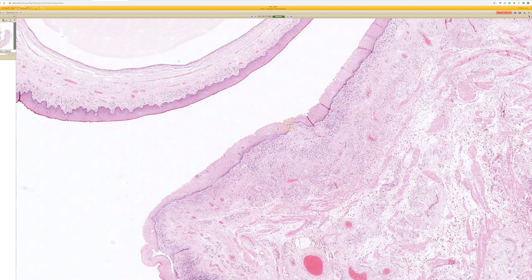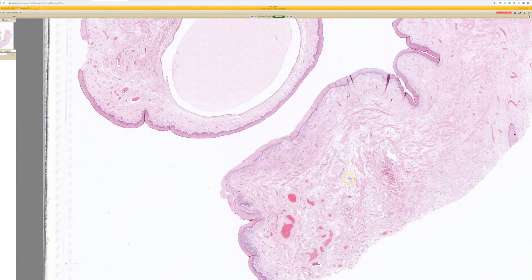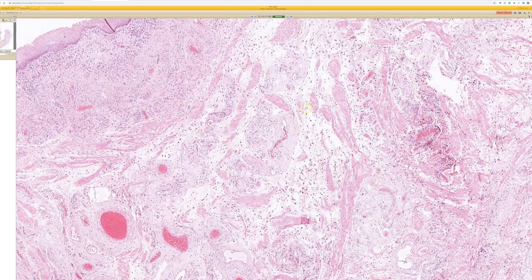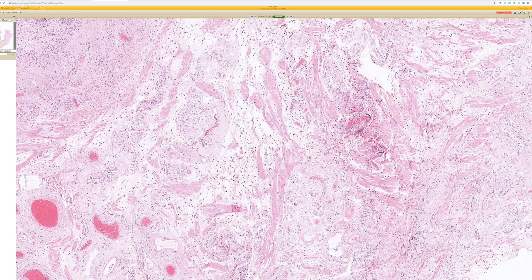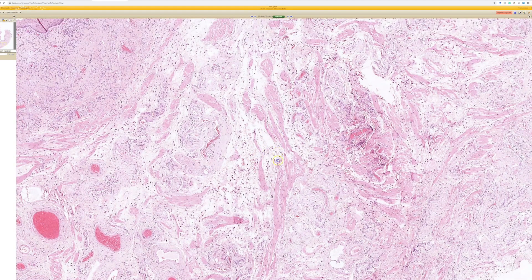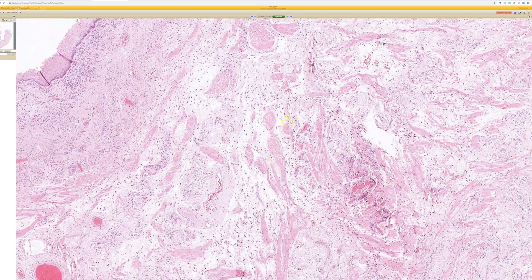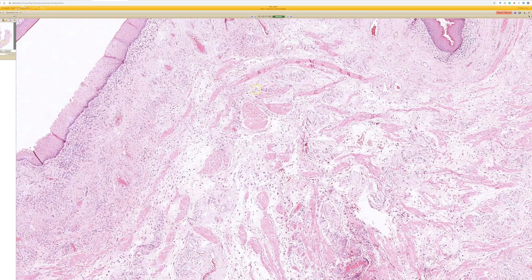You can particularly see it over here — it definitely looks like mucosa. And look what we see in the submucosa or dermis. Sometimes in sites where the skin and the mucosa blend together, like on the ventral surface of the glans penis in this particular case, it can be hard to tell whether you're actually dealing with dermis or submucosa. So sometimes in my report I'll say dermis slash submucosa in areas like this because there's not a discrete dividing line.